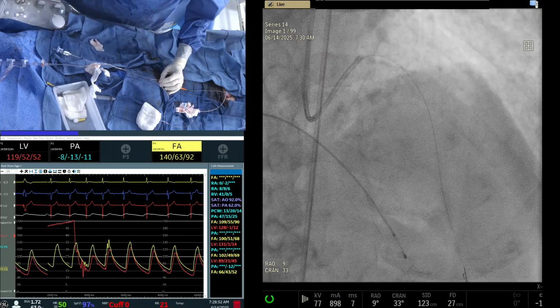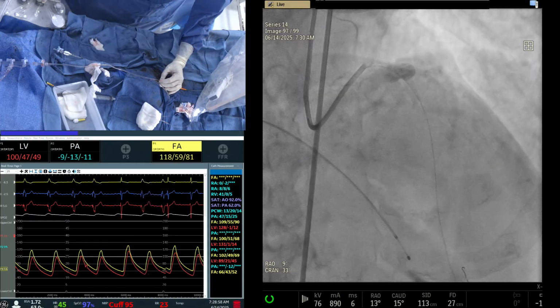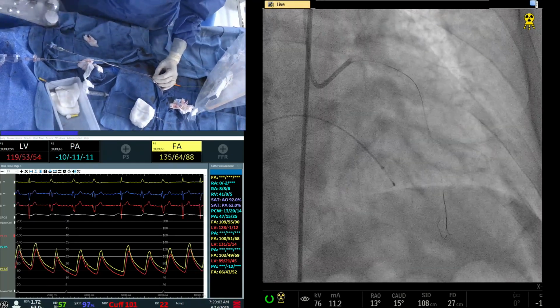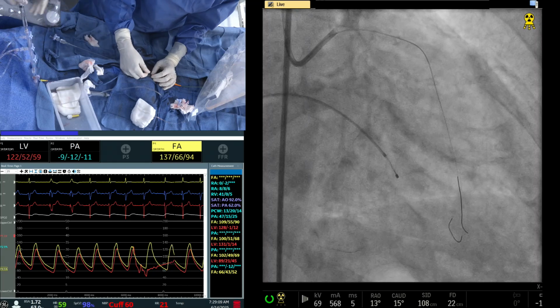No, bad disease. At this point, I think imaging would be warranted to decide what we should do with the proximal lesion. Agreed. Maybe I think balloon itself will do. We may not have to take another calcium modification device at all. The Verapamil, okay, will mix. Go. We are deciding the length of the distal.